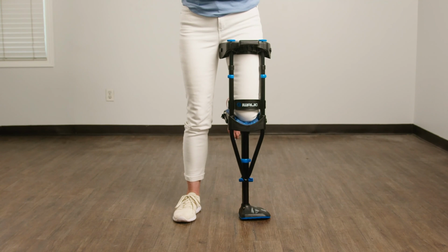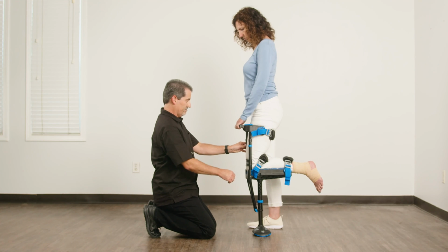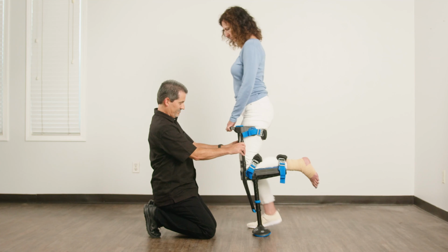Before you get them walking, you're going to have them do a training exercise. This simple drill will give them a feel for the device and prepare them for walking on their own. Have the patient grasp the handle, then hold the crutch by the 2 upper tubes.